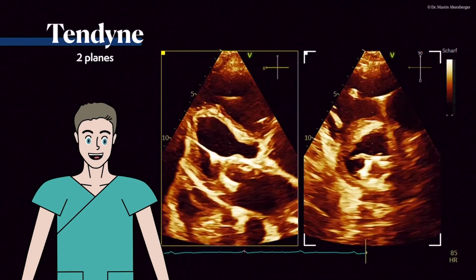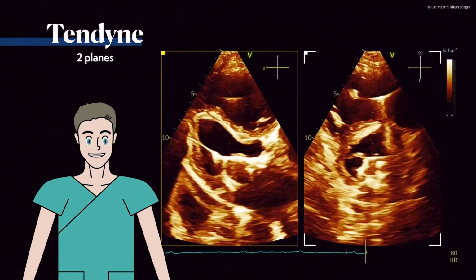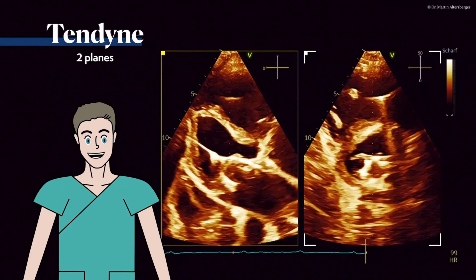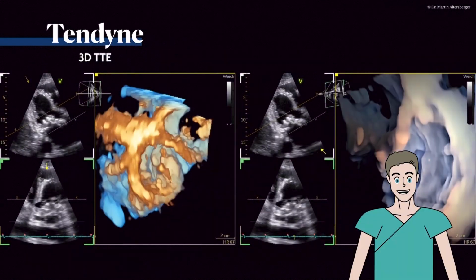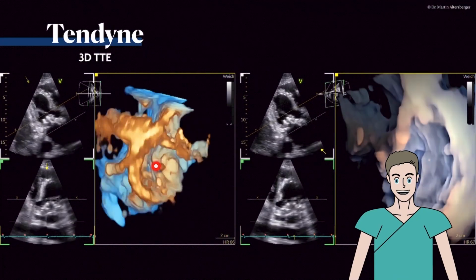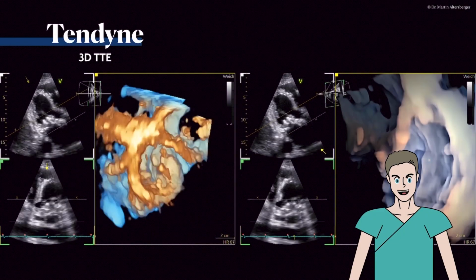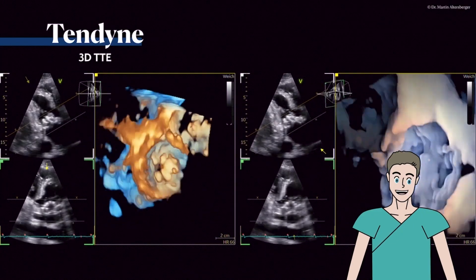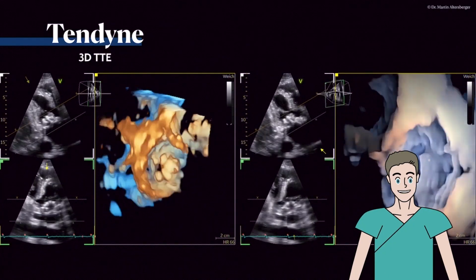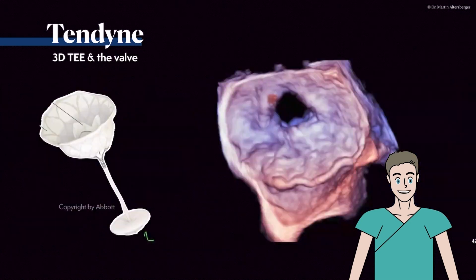Here you see it in a transverse plane, the residual opening and closing of the mitral valve, which is of course not relevant anymore because there's this huge umbrella below. How does it look in 3D? This is a TTE study. From the top we see here the opening and this umbrella-like structure, and here we are looking from below towards the valve, and we see with this special light, the flexi light, this umbrella-like structure, and here the opening of the mitral valve.